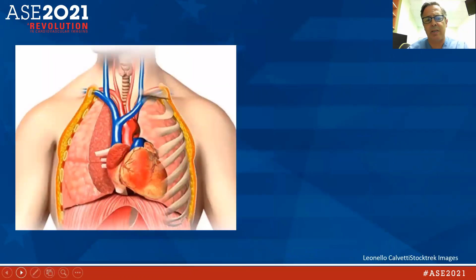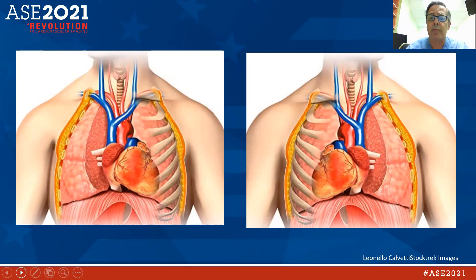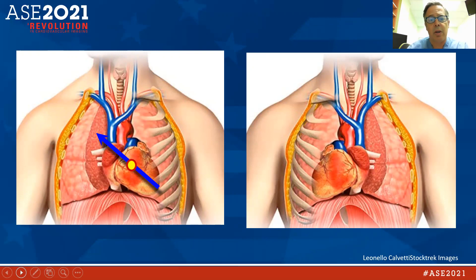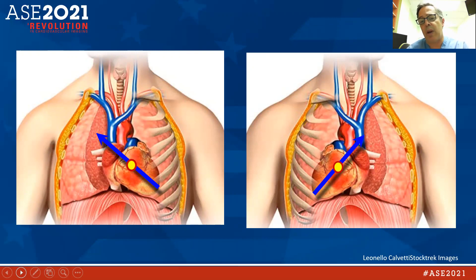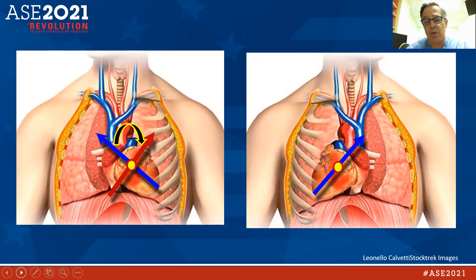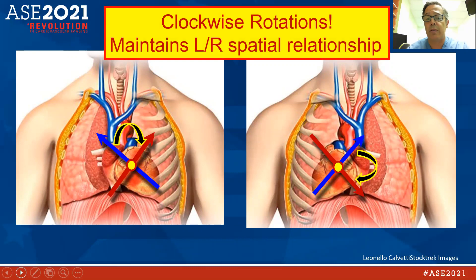The difference between scanning a patient with levocardia versus dextrocardia is the placement of the parasternal view. For dextrocardia, the marker would be oriented toward the base of the heart, toward the left shoulder — opposite of what we'd normally see — and probe placement is on the right parasternal. Clockwise rotation for the parasternal short axis view is very important because this helps us maintain left-right spatial relationship.